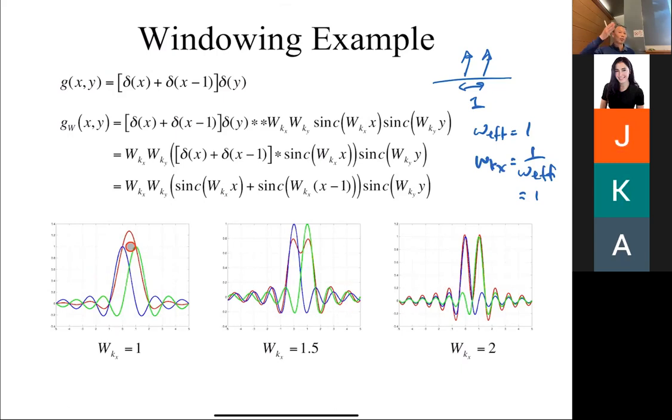But since it's a design rule, it's saying, well, right at the limit, that's the limit where you just can't resolve it anymore. But if I just go beyond that limit and make wk, let's say 50% bigger, so now I go 50% more in K space, you can sort of see we're resolving the limit even better. Now you can see the sum of them has this peak and this peak. And if I double where I go in K space, you can resolve the peaks really well. Okay.